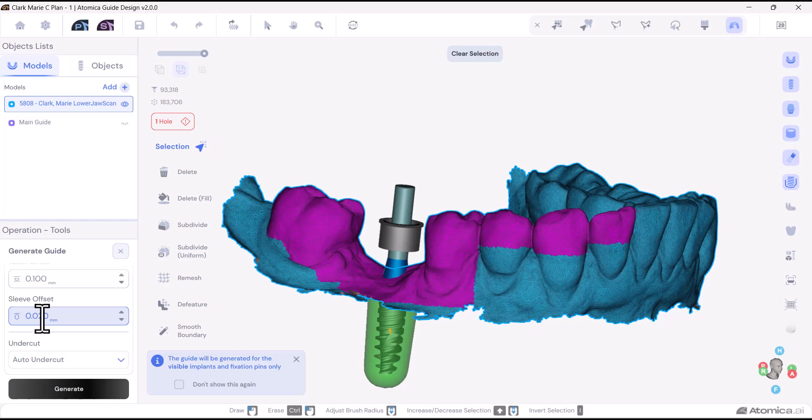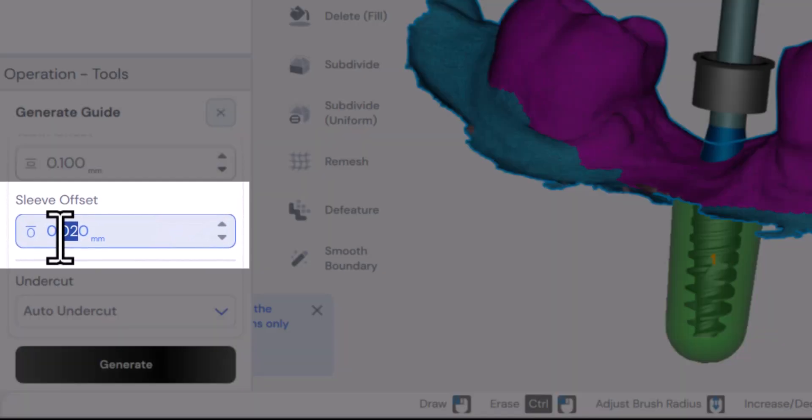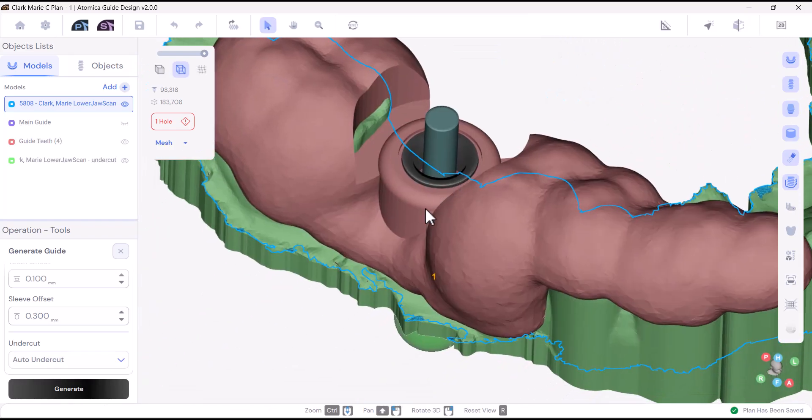And finally, the sleeve offset is the space between the metallic sleeve and the sleeve space in the guide. This parameter should also be balanced — not too tight, to allow proper seating of the sleeve, nor too loose, to prevent mobility of the sleeve during surgery.